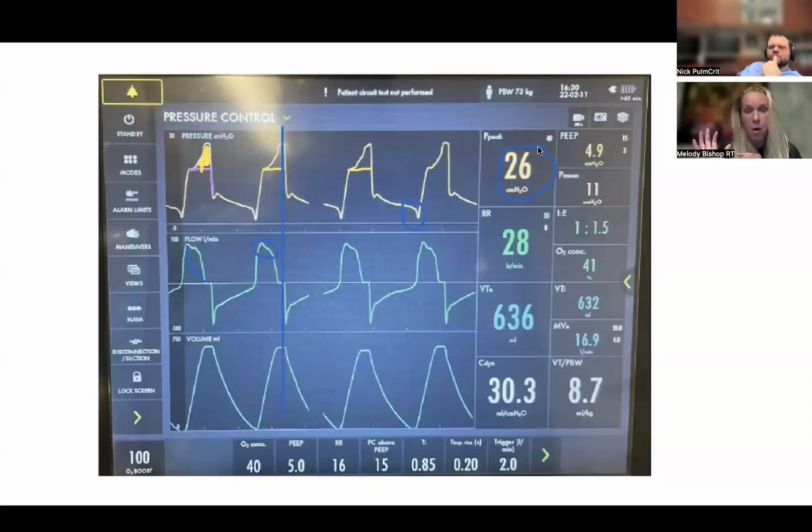Try to fix the auto-PEEP the way you can by shortening your inspiratory time. Give them a bit more support to satisfy that shortness of breath that they're feeling. Get rid of the dyspnea, and then from there, see if we can get them to settle. And at the same time, maybe ask the nurse if there's a PRN sedative I can give them, just to calm them a bit so I can try to get them more comfortable.